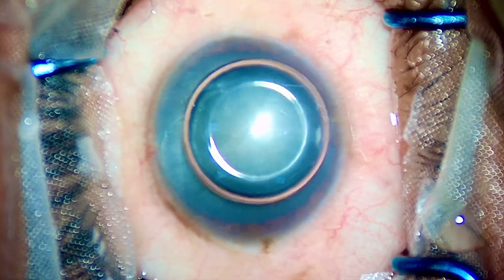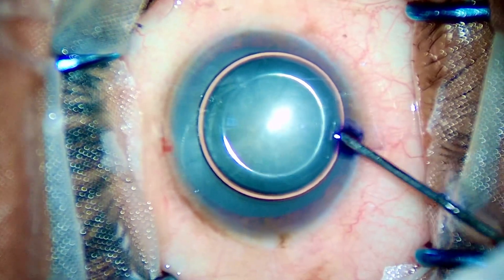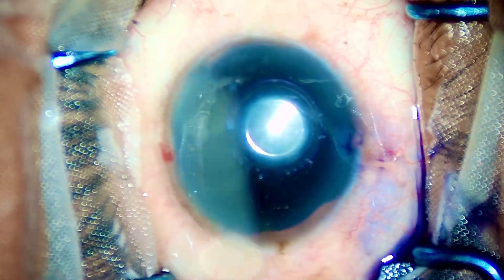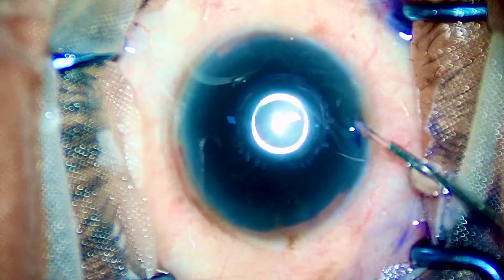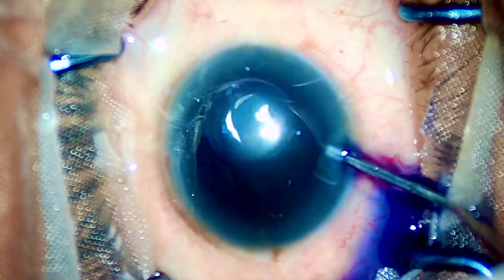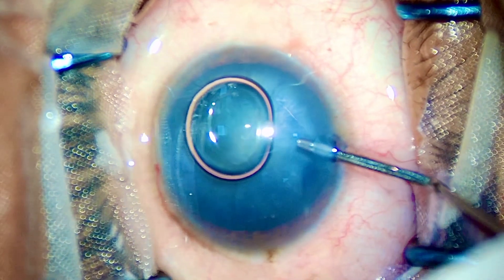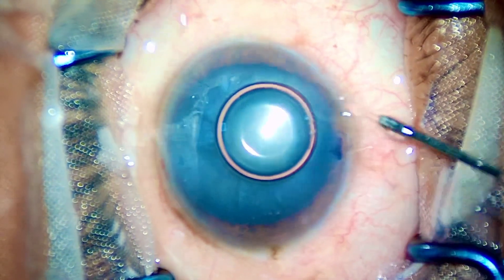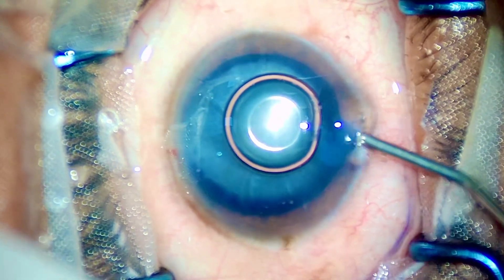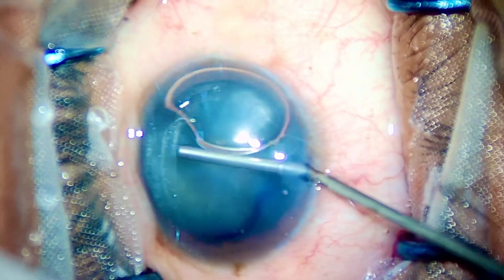Is it worth it to spend upwards of 1 lakh rupees in India for getting femto laser-assisted cataract surgery, or is manual cataract surgery just as good as FLAX? If I tell you my honest opinion at just the beginning of this surgery, I would say both of them have their own places.